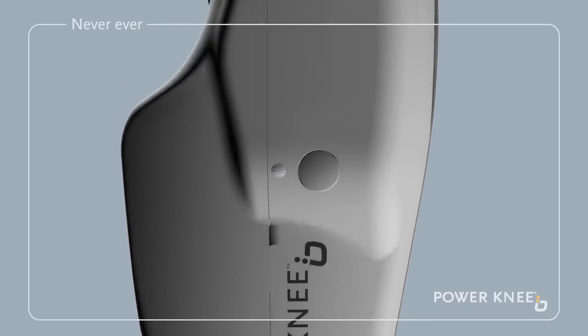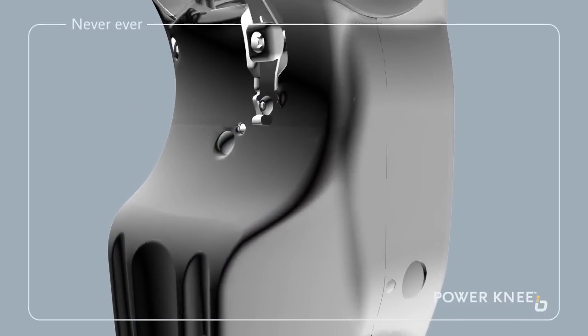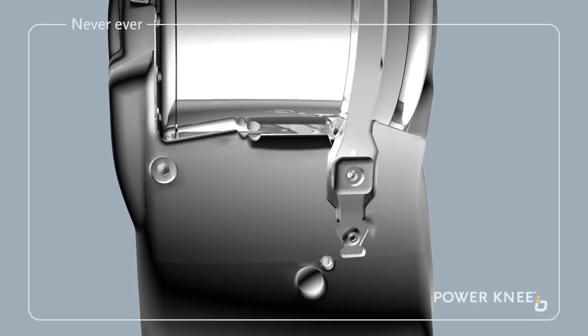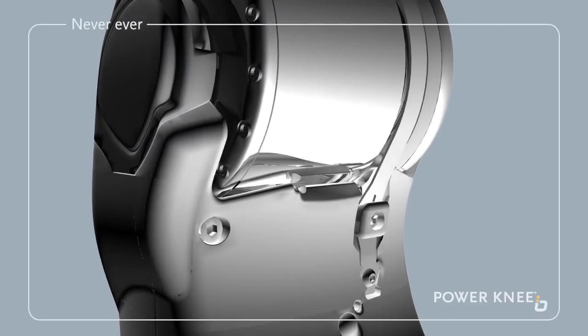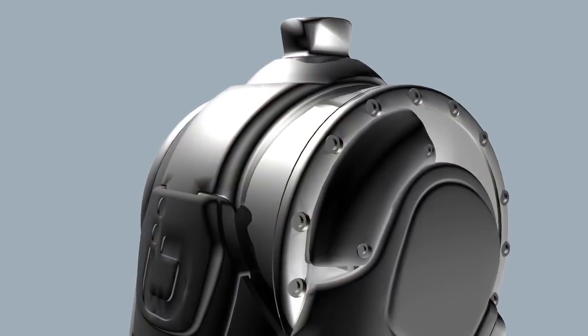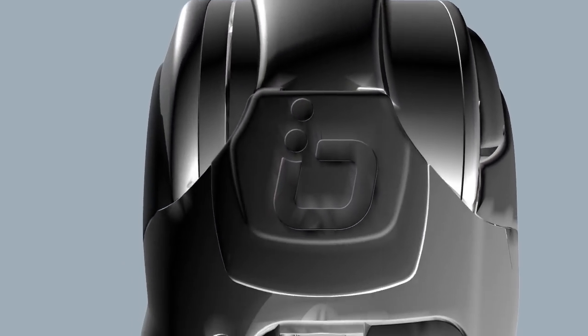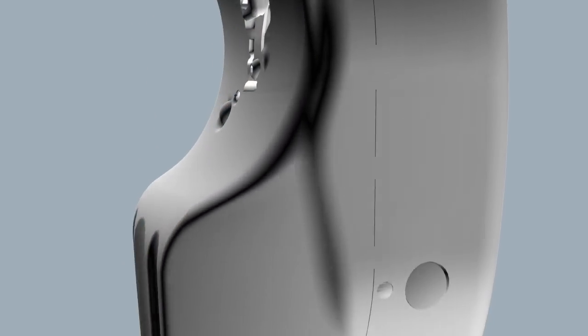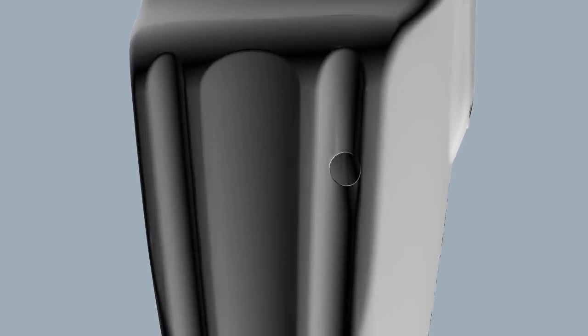Turn the knee's power off while performing tasks which may be critical to your safety, such as driving a motor vehicle or operating a power tool or other potentially dangerous machinery. Now that we have gone through the essential safety precautions, let's take a closer look at ways in which the new Power Knee can help you live a life without limitations.